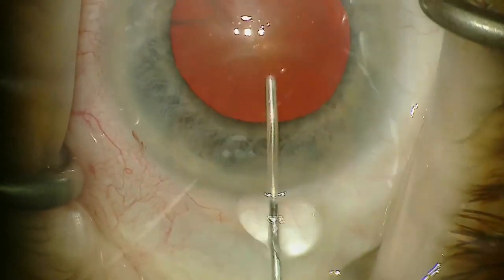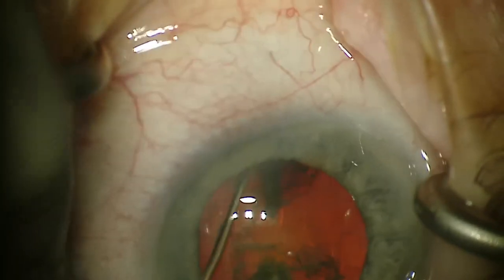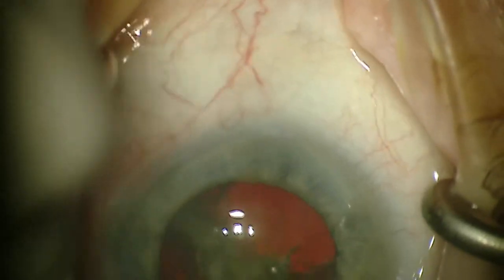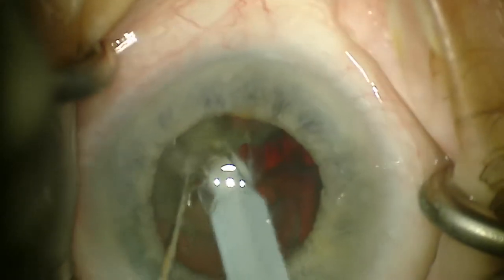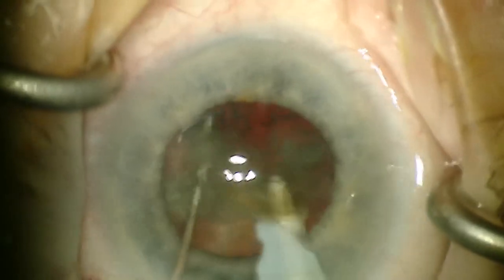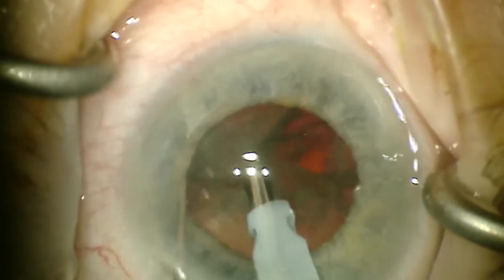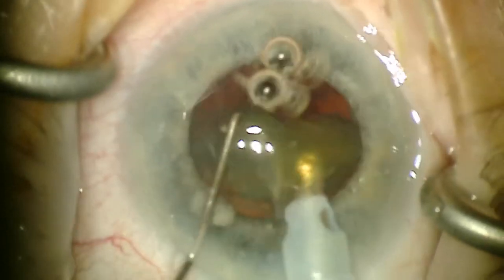It's just our standard normal bimanual incision. We go straight in after we've made the capsulorhexis and hydrodissected to a FACO chop technique. Try not to have to rebury. We just leave the FACO tip right at the base of the nucleus and you can just turn the lens with the FACO tip and quite easily re-aspirate. This reduces your effective FACO time quite dramatically by not having to do any more FACO than necessary.